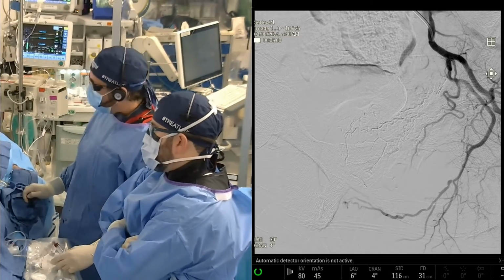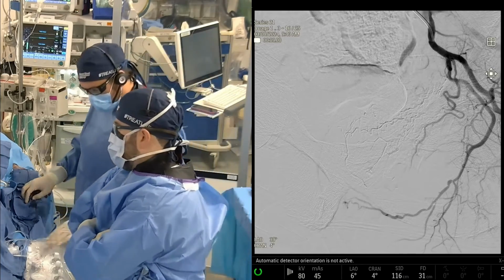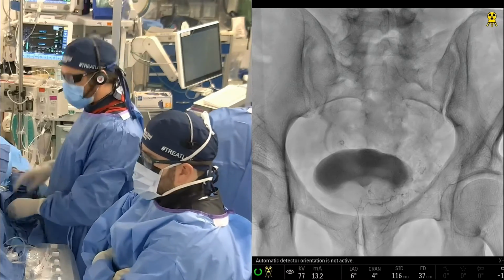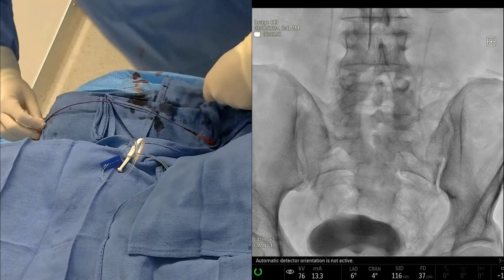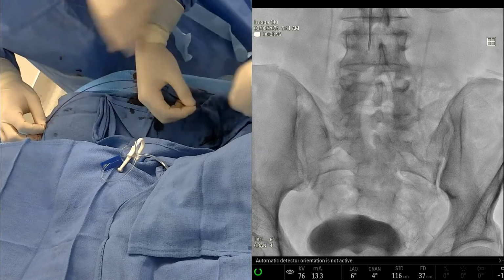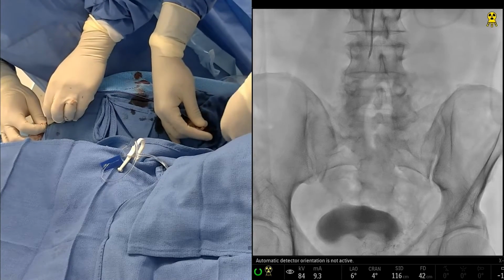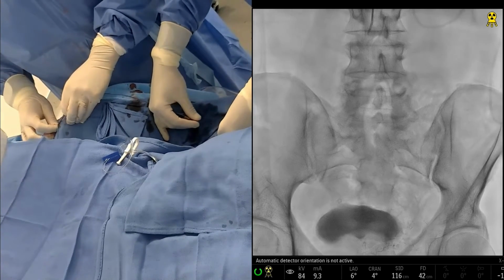And just to highlight the collateral that we saw, the control that we had, there's a conversation now where we're at a place with prostates where it's retreatment, recurrence. And one of the ways to prevent that is going into collateral vessels, coiling things off. None of that was necessary here. Again, there are a lot of operators that, and sometimes with us, even if we were doing particles in the past, would have gone there, seen the collateral, coiled it off, and then had to do the primary embolization. And just another demonstration with glue about how it's a one-shot deal with the control that you have, and it's incredibly fast. There's a really nice example.